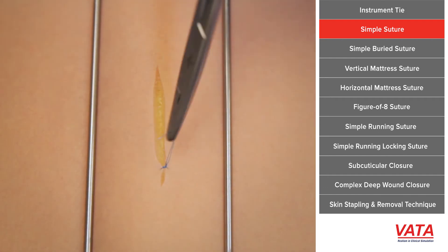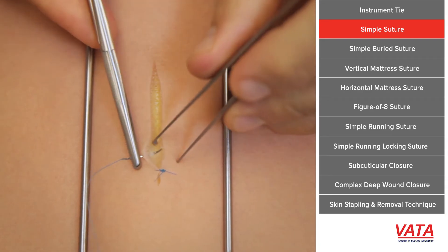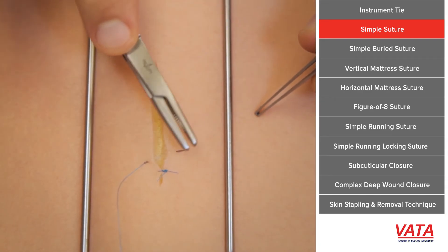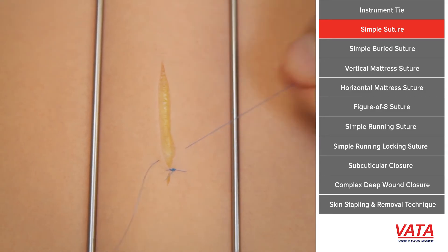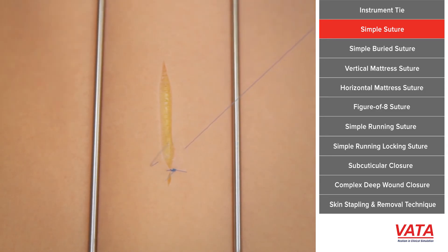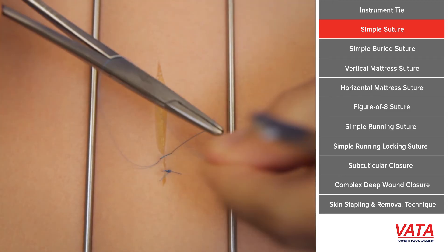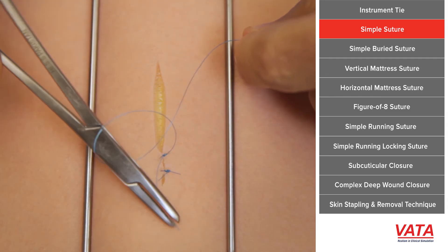That's why I like to do it in two passes and not try to run the needle all the way across. Do the instrument tie as I've already taught you, and see how nicely the skin is approximated. As you start doing this more and more, you'll just get faster and faster — it is an acquired skill. The key is to enter at 90 degrees; sometimes you push the skin just to make sure you're getting through it at 90 degrees.